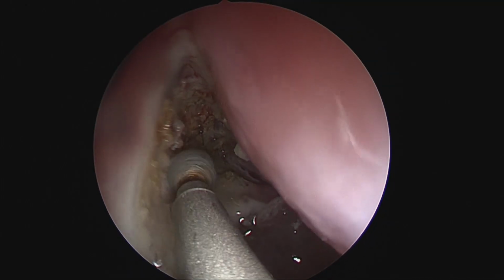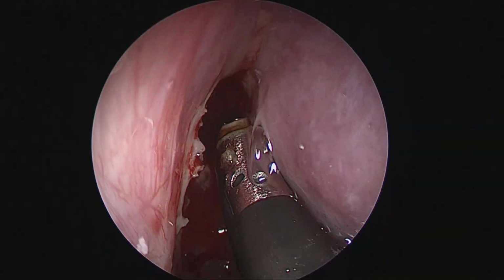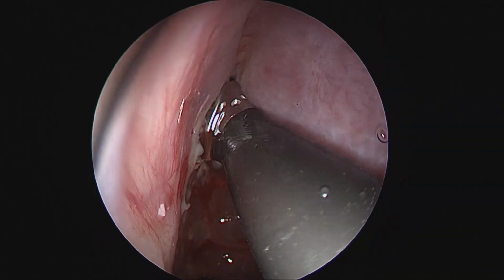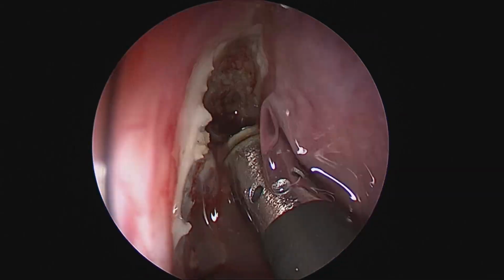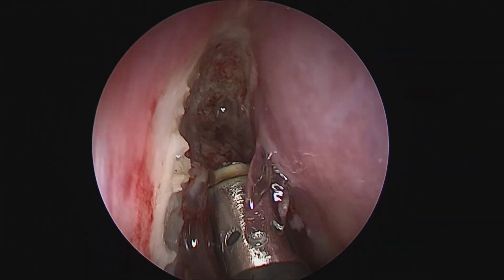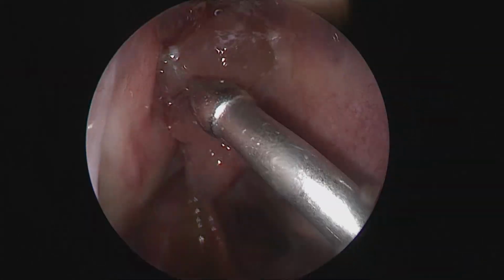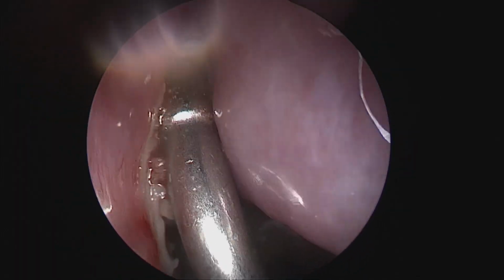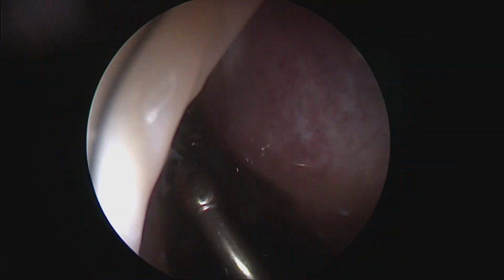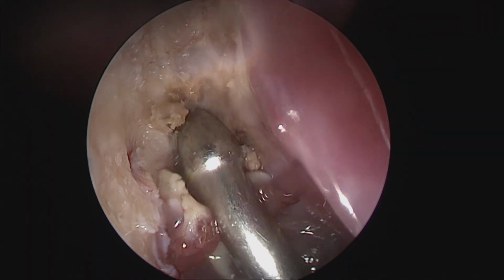So what we do is, once we have exposed clear bone, or normal bone, around the pathologic process, that is the inverted papilloma, we initiate drilling onto the normal bone so that we can start moving progressively towards the lesion, being very sure that we are not omitting any part of the lesion behind. Now we see here we are using drilling as well as subsequent coblation, a combination of these two modalities, to be able to completely resect this lesion.